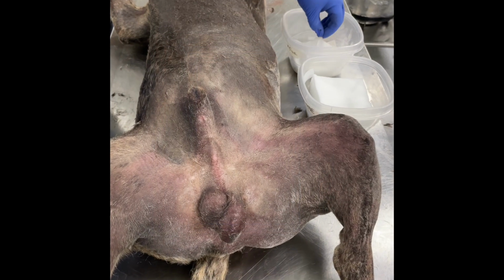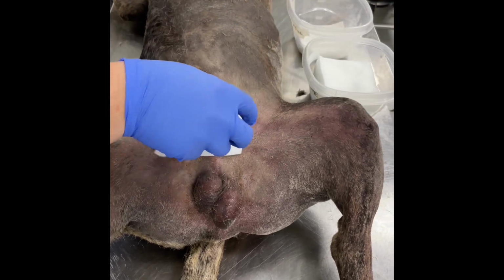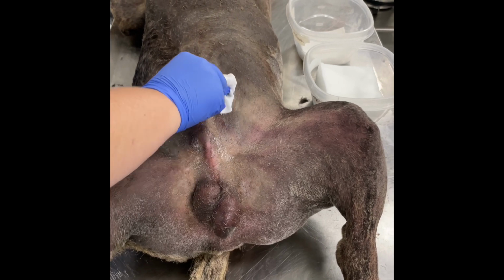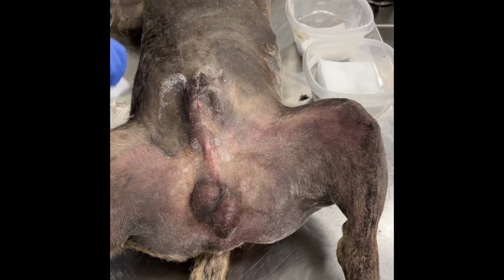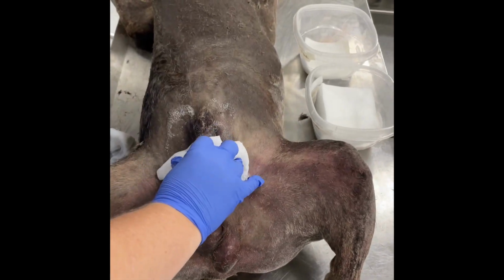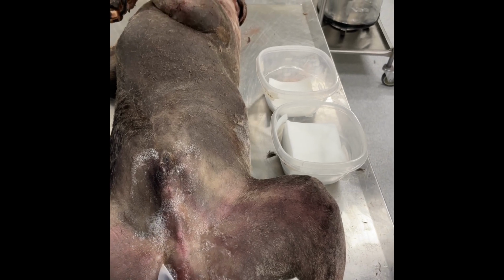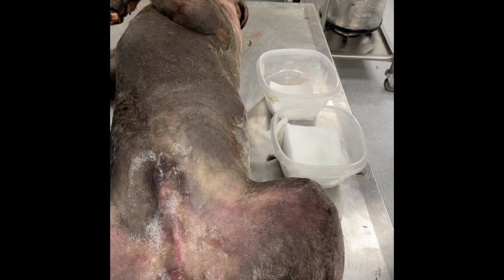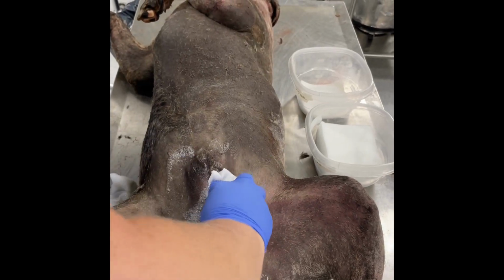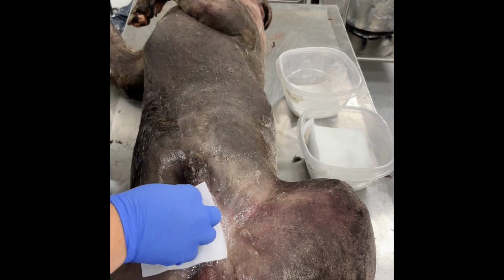So in this video, I'm going to show you two different ways that you can scrub a neuter. My personal favorite is to start in the center, do one swipe up, toss the gauze, start in the center, do one swipe down, toss the gauze, and then start in the center and go to the left and go to the right. The reason that I like to do it this way is that it prevents me from accidentally contaminating my incision site, because my gauze is never going back towards the center of the patient.